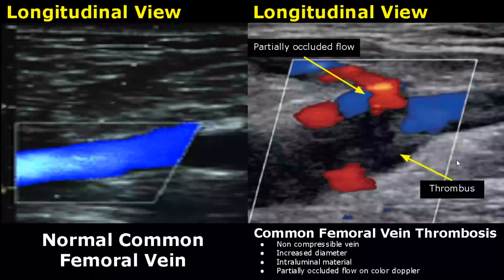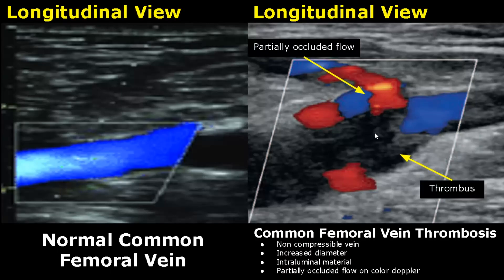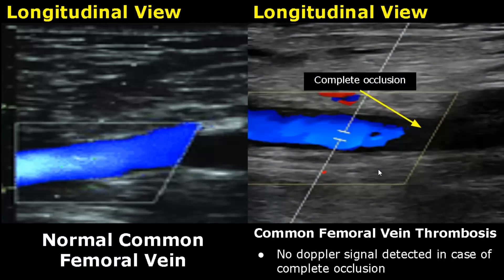Here is a longitudinal view showing common femoral vein thrombosis with color Doppler. There is no flow in this area but there is some flow over here — it is a partially occluded flow. In this image there is complete occlusion due to thrombosis, with complete absence of blood flow.